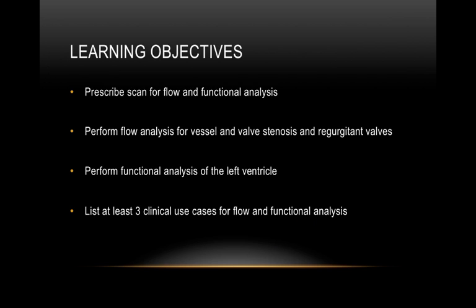After the presentation, you should be able to prescribe a scan for flow and functional analysis, perform the actual flow analysis for vessels and valves with stenosis as well as regurgitant valves, perform functional analysis of the left ventricle, and list at least 3 clinical use case scenarios where flow and functional analysis would be performed.